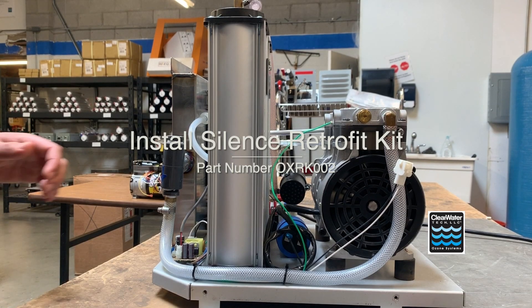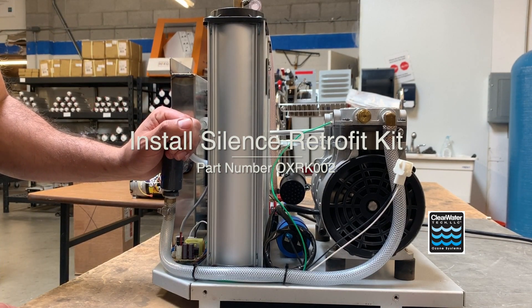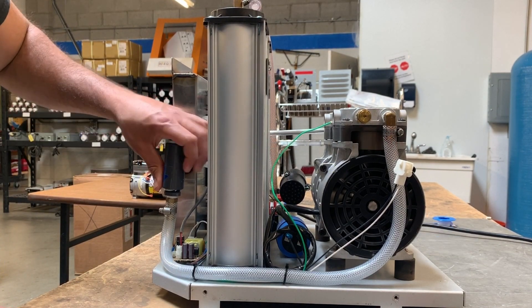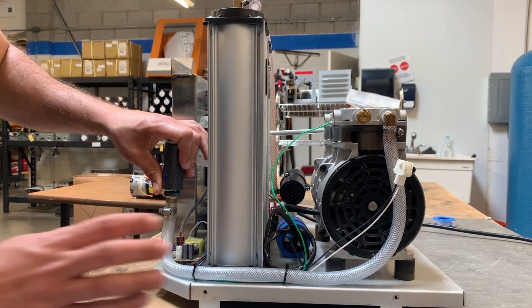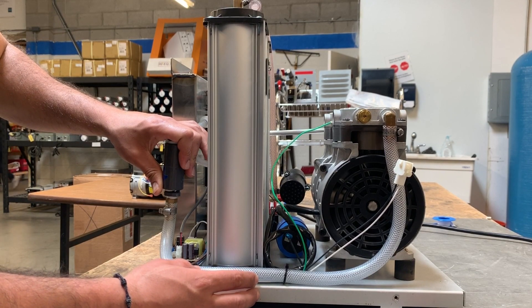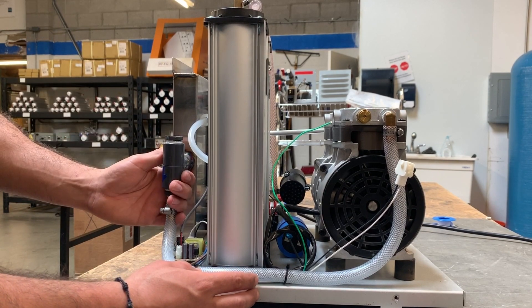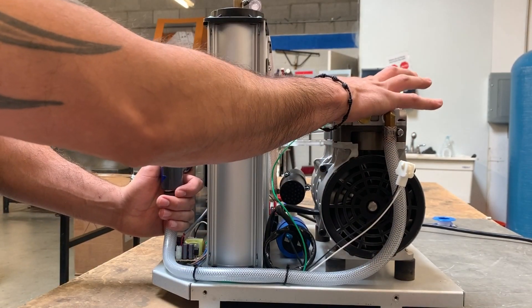Today I'll be showing you how to install our silence retrofit kit on our oxygen concentrators. All our new builds come with it already, so it's only for those who have the older style. If you purchased it maybe early 2020, we're going to start off by removing the compressor and swapping in a quieter one.